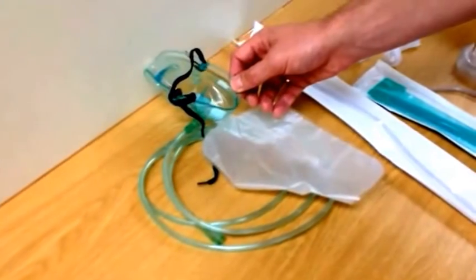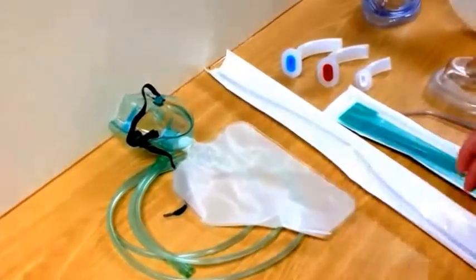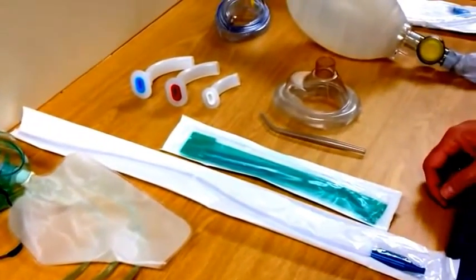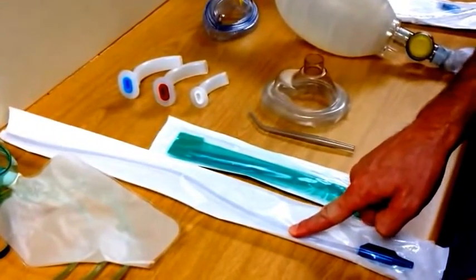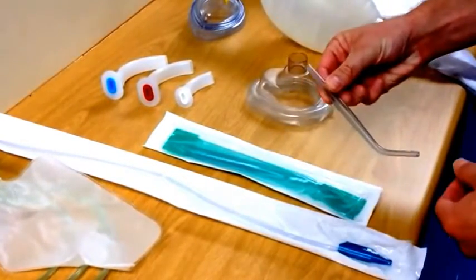You should have a high flow oxygen delivery device or oxygen mask with tubing. You should have a selection of suction devices — in this case soft tip suction and a hard Yankauer type suction device; this is what it would look like outside its sheath.